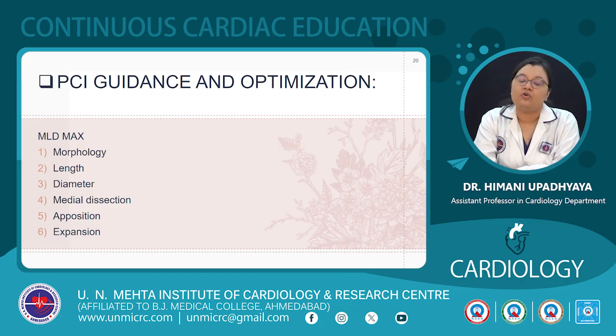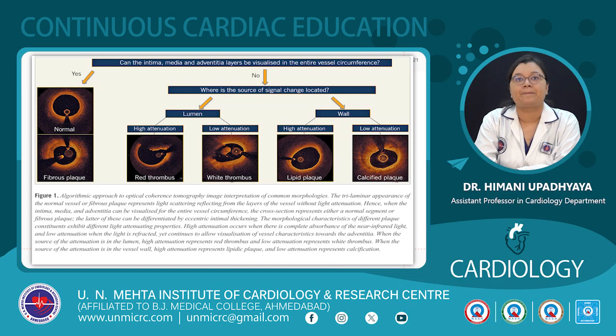Now, the role of OCT in PCI guidance and stent optimization. There is a mnemonic, MLD MAX. M stands for morphology, L for length, D for diameter, then M for medial dissection, apposition, and expansion. So for lesion morphology, we have already learned the lesion characteristics before. This is a quick revision.